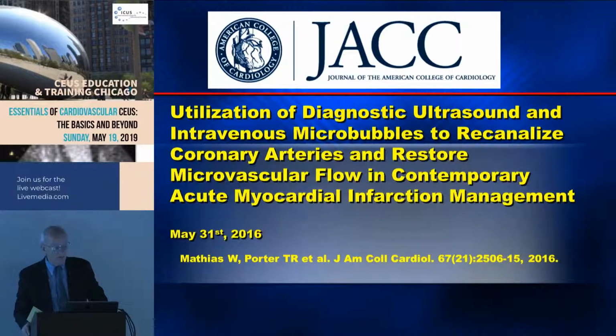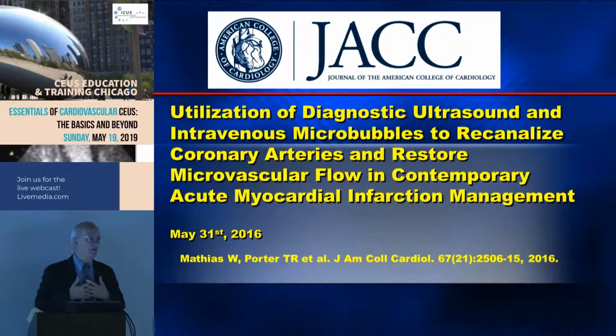All right, Tom can talk more about this, but this is a most remarkable thing. So a patient comes in, is having a heart attack, and the heart attack is often caused by a thrombus or a blood clot in the artery of the heart, usually sitting on top of some plaque of some size. So who thought that if you used microbubbles intravenously and put the ultrasound beam over the heart and you pop the bubbles, or let's call it disrupting the bubbles, you could disrupt the thrombus on the plaque and open the artery, right? So this is very big news. Tom has been on this with Wilson Matthias in Brazil. Now there are other people in Holland, up in Canada, beginning to move into this. So these were the real pioneers.